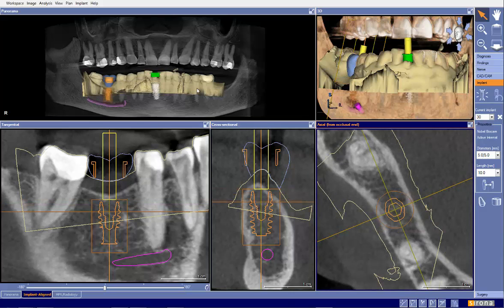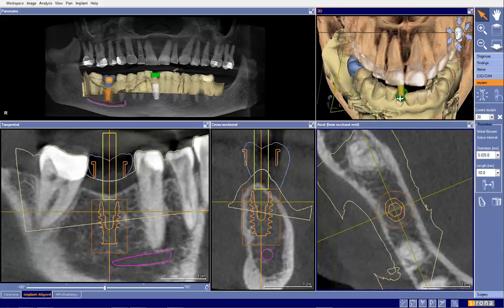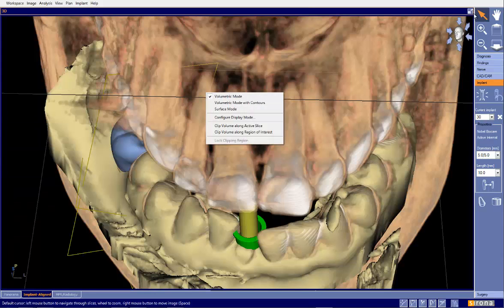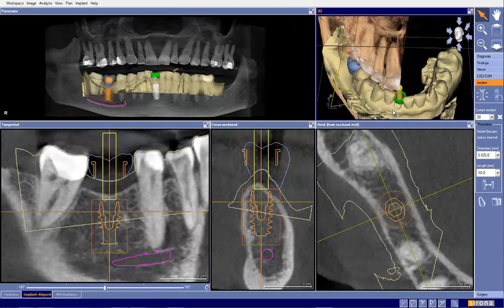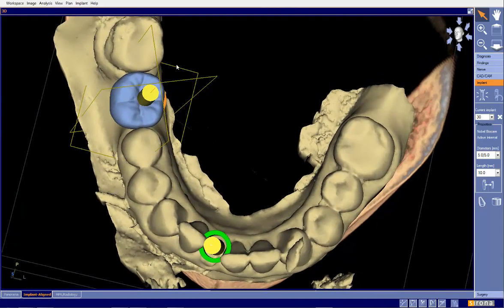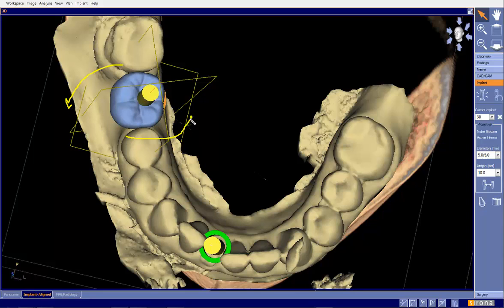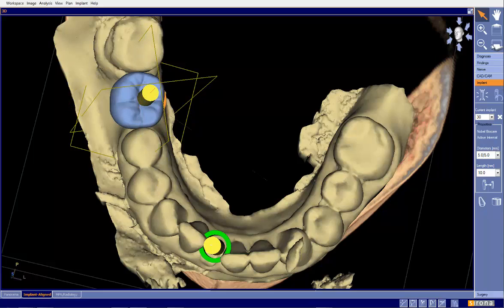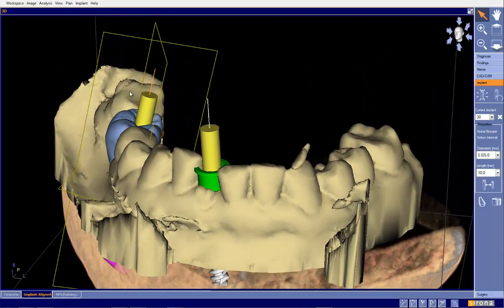The first thing I look at when I see this case is this is a great OptiGuide case. We've got good CEREC data here and a relatively well-planned restoration. My only comment is that the tooth is a bit rotated here. I would rotate it out so the tooth is straight in line with my central grooves. If we look at it from here, we can definitely see that rotation.